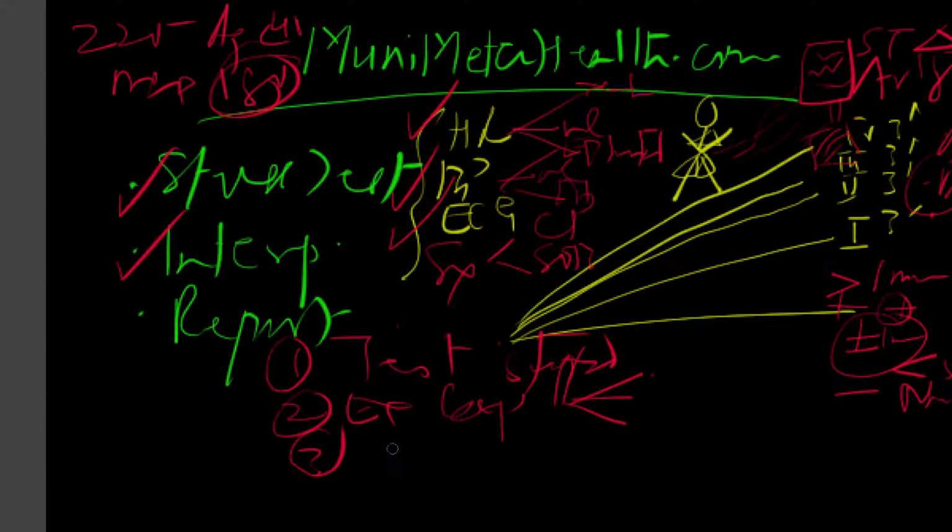Now, three, you'd like to see and define how many METs if you can, because many times now the monitor itself will define 6 METs, 10 METs, 15 METs, etc., depending upon the exercise capacity that the person has achieved.